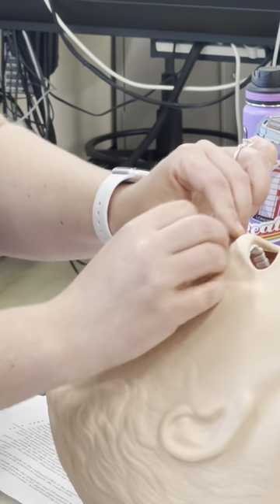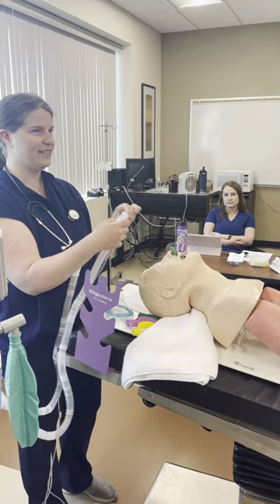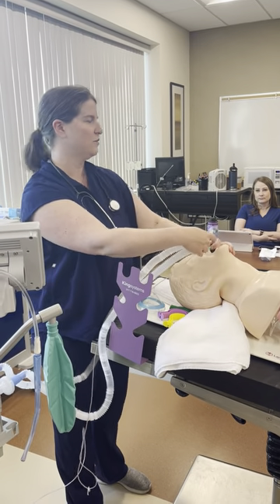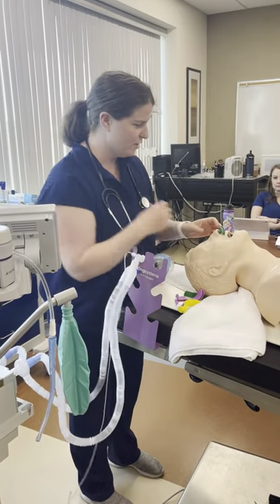There's a guy in Bakersfield who takes an ET tube connector, sticks it in the trumpet, connects the circuit, and ventilates his patients that way. He just closes them off and ventilates, which I've done in a pinch — it works.